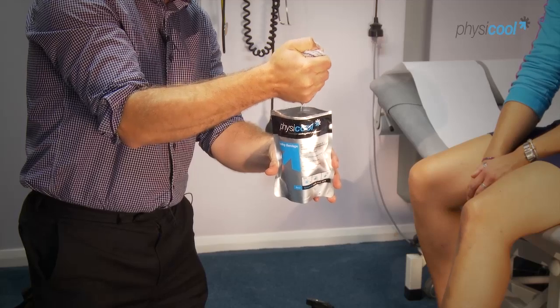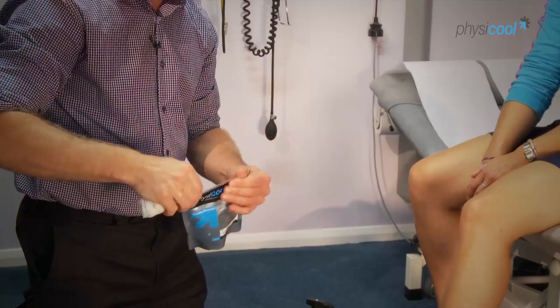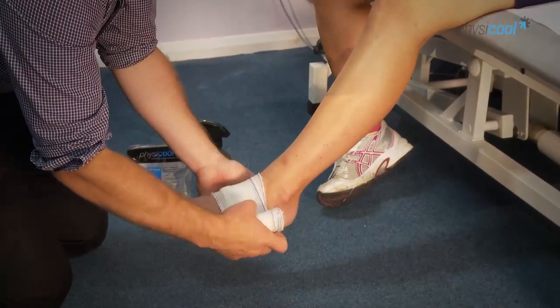That cooling liquid goes back into the packet and can be saved for the next few uses. Just reseal that up and apply the bandage like you would normally for any typical ankle bandage.